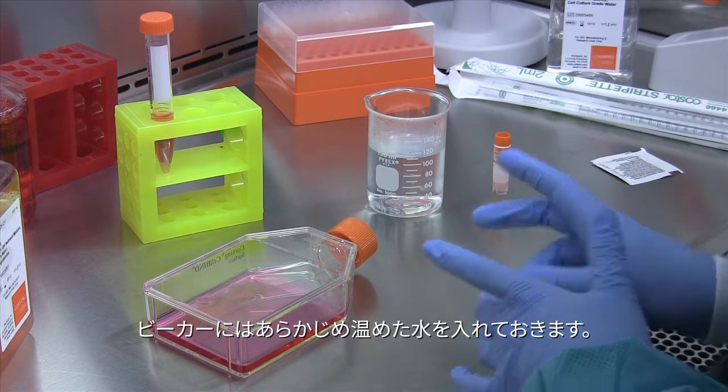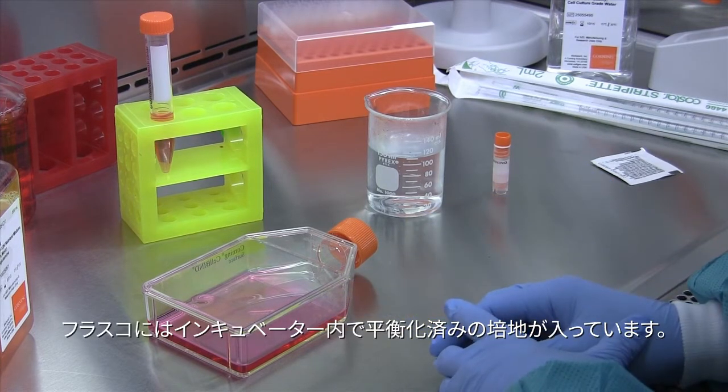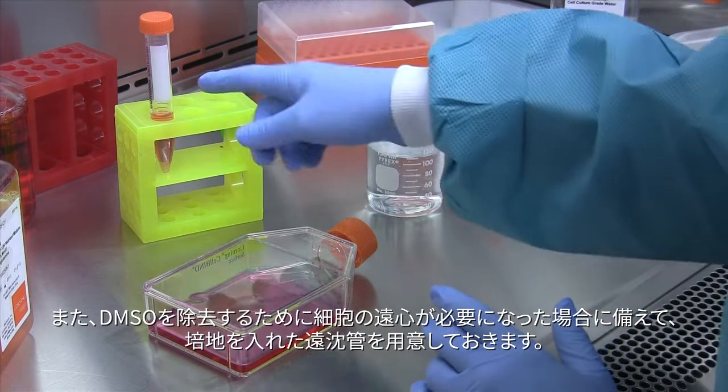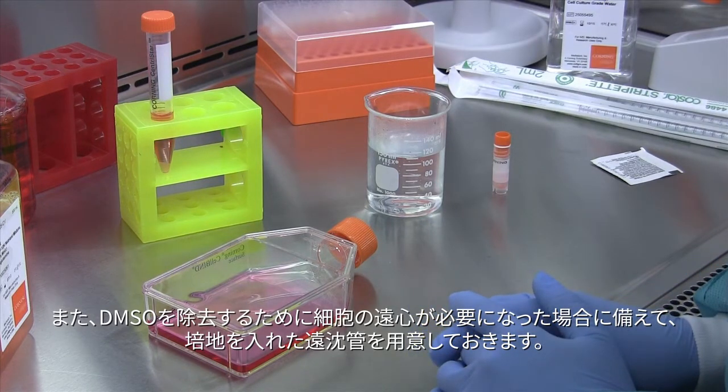Here I have a beaker filled with pre-warmed water. I have a flask with pre-equilibrated media that was in the incubator. And I also have a conical vial with media in it in case I choose to spin down my cells to remove the DMSO.